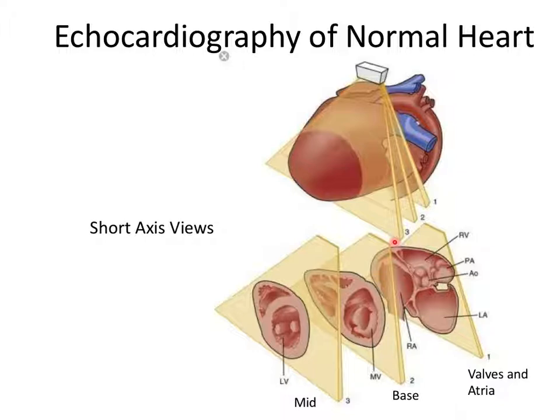And so getting a window through the ribs is kind of difficult, right? Because they're far away from your transducer. So for people who are relatively obese, or you can't get a good view with the transducer, you throw up your hands and you take them to MR, magnetic resonance, where you can see all the way through without any problems. Right?